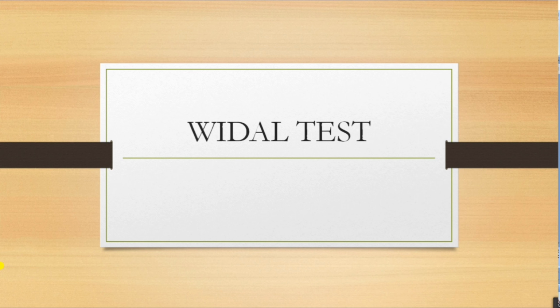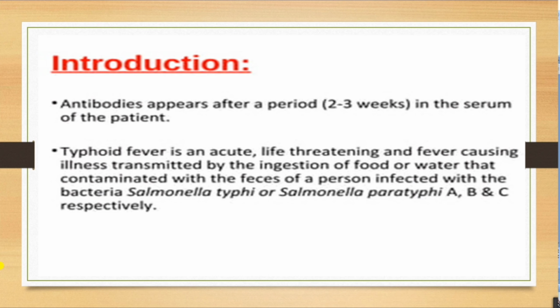Today we are going to discuss the Widal test. The Widal test is an agglutination test, or tube agglutination test, done to detect Salmonella infection or typhoid fever, which is an acute, life-threatening and fever-causing illness transmitted by ingestion of food or water contaminated with the feces of a person infected with the bacteria Salmonella typhi or Salmonella paratyphi A, B and C respectively.